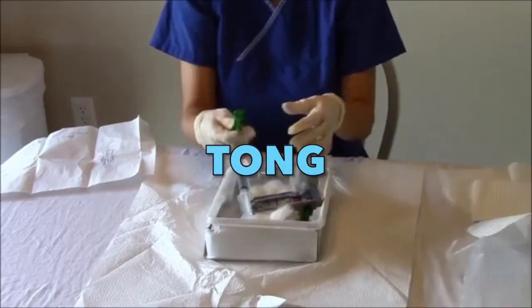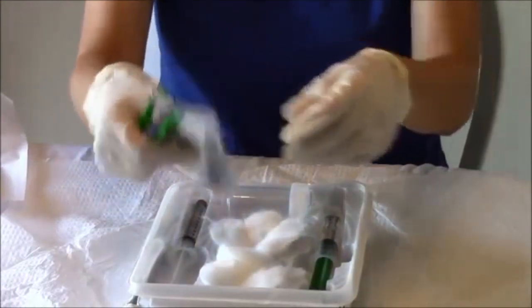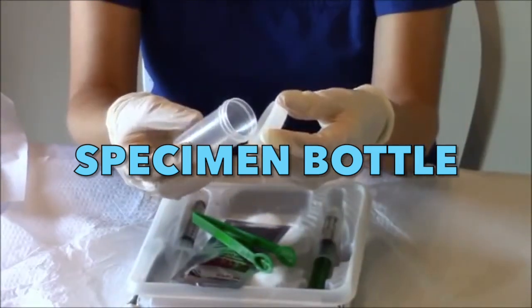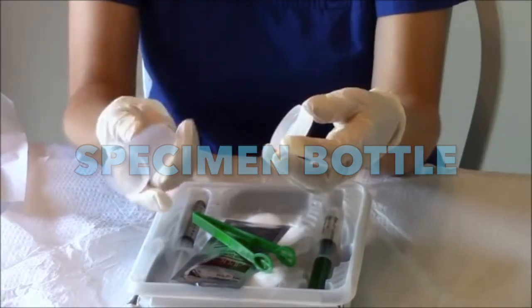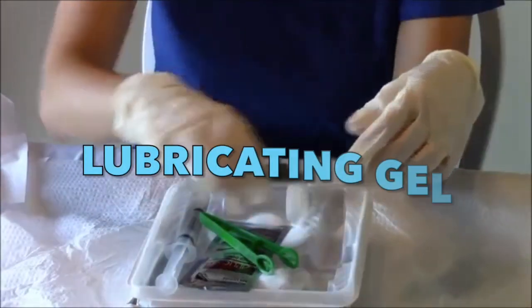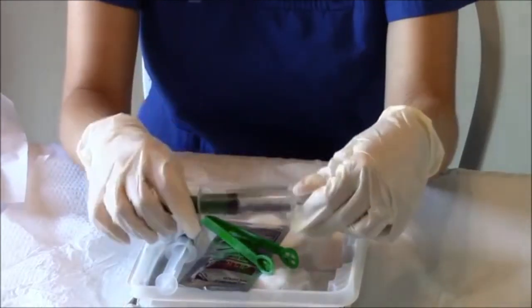We have here the tong, which we will use to handle the cotton and the betadine applicator. You can pour betadine onto the other cottons as well. We also have a specimen bottle, because later on we may need it for urinalysis or urine culture. This is the flush — a 10cc sterile water syringe. And this is the lubricating gel, which we will use during the insertion of the foley catheter.